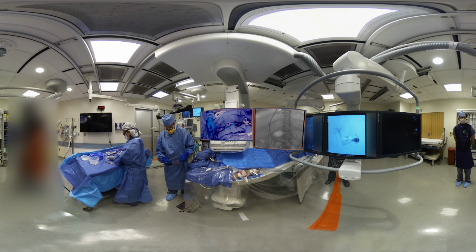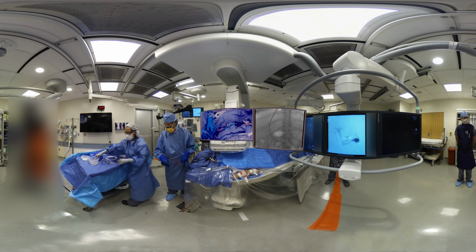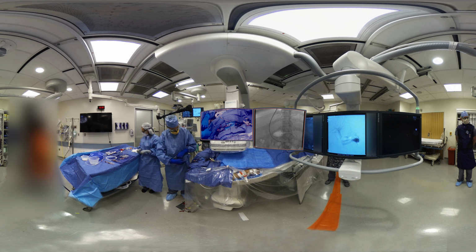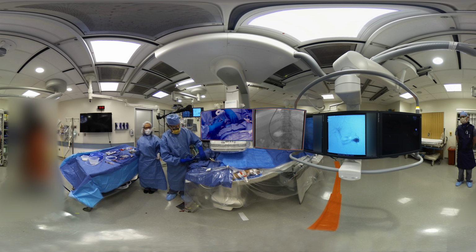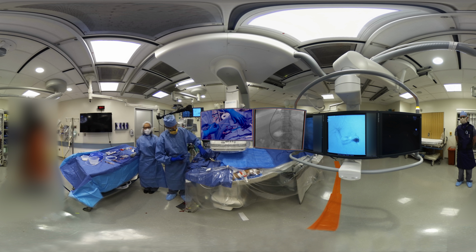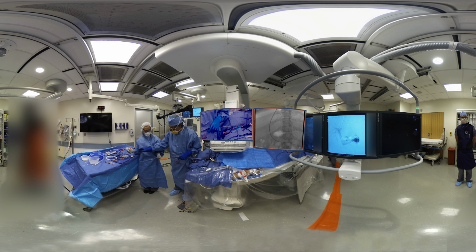Let's get the balloon out. If you'd be so kind as to hold the guide wire. Okay, I like to take the sheath and the balloon out together because it's less messy. So I'm going to bring the sheath, pinch pull it all the way back to the hub of the balloon so that the two are nearly mated. And now I'm going to take the back of the wire so that you can take the two out together.